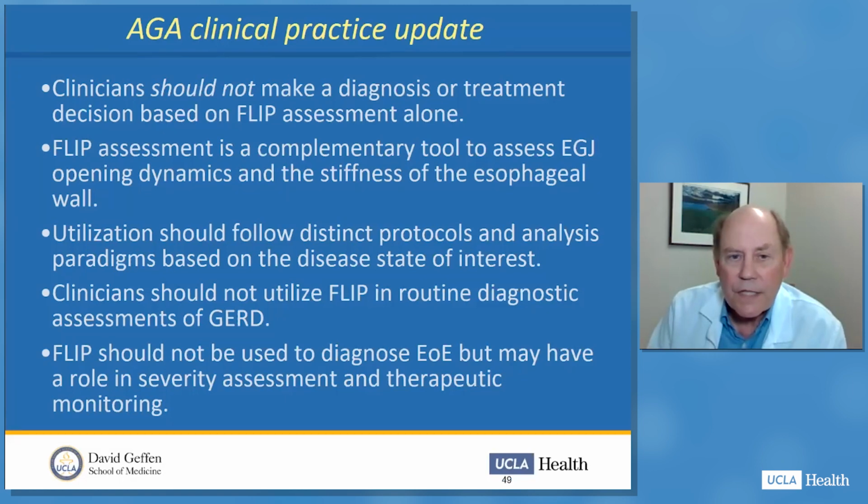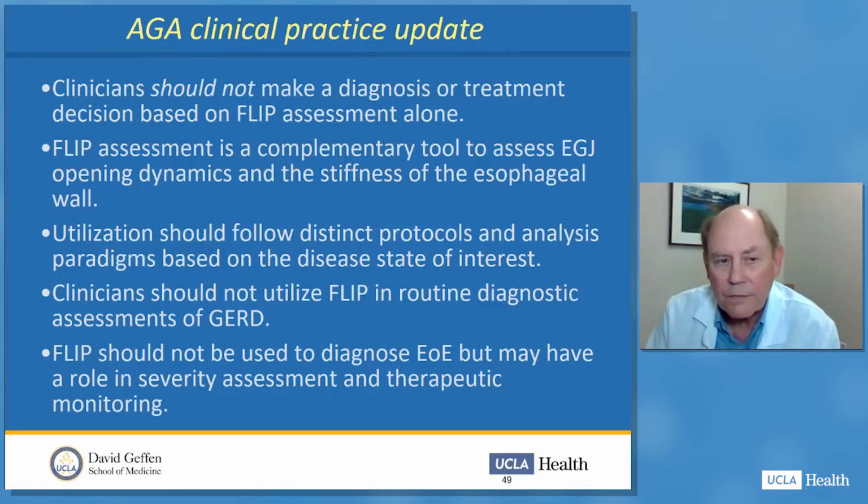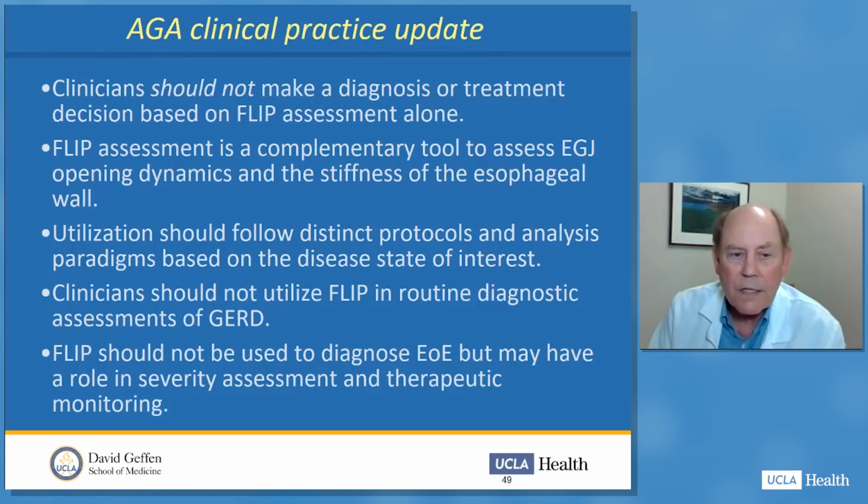They say that FLIP assessment is a complementary tool to assess EGJ opening dynamics and stiffness of the esophageal wall. Its utilization should follow distinct protocols and analysis paradigms based on the disease state of interest, and that is being done. Clinicians should not utilize FLIP in routine diagnostic assessments of GERD. That makes sense. It's not a way to measure GERD.